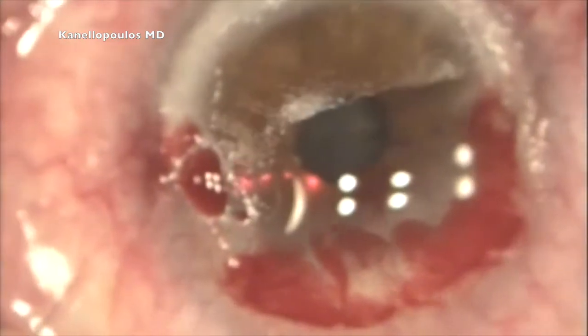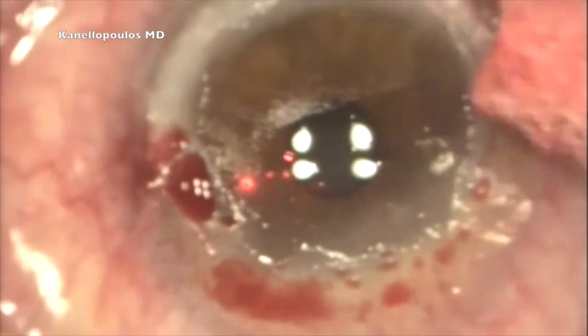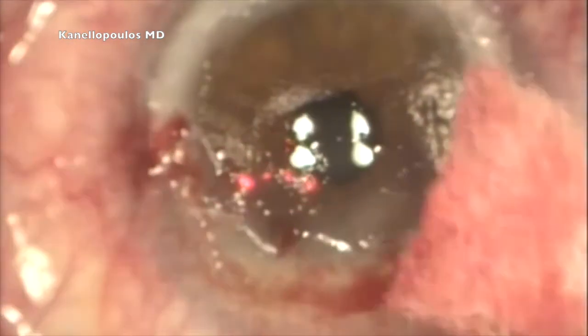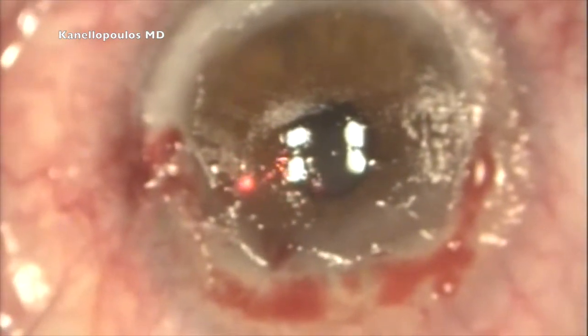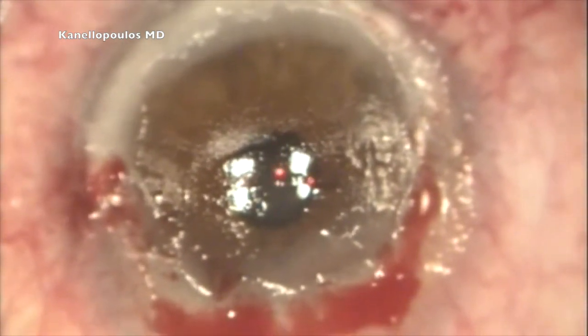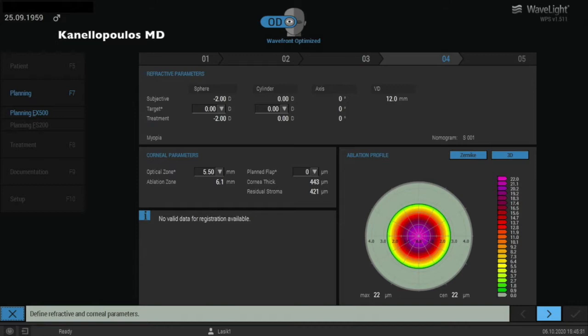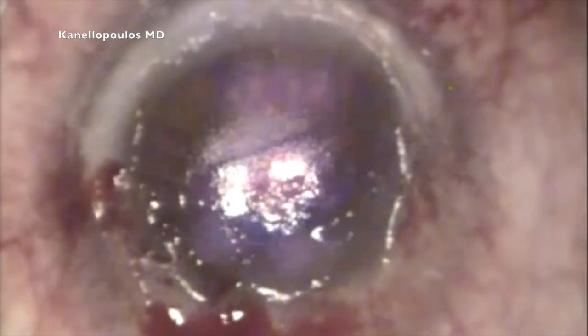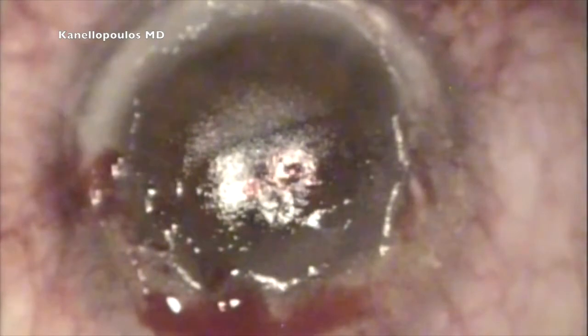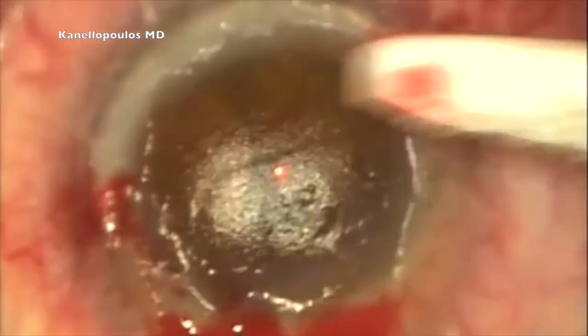We removed the Salzmann scars from the central cornea and we were left with a concavity right in the center. So here we're going to use some BSS as a masking agent. I'm placing a drop of BSS and I'm going to use my Weck-Cel sponge to try and create a masking cover to the actual concavity, and treat the myopic version of the refractive error of this patient. The PTK treatment will make him turn a little bit myopic. And you can see here how we're now employing the EX500 Excimer laser and I'm viewing the irregularity.